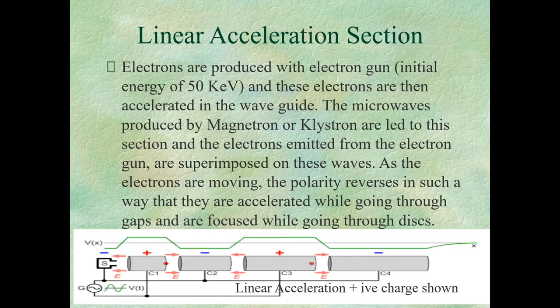So the target is water cooled, as a lot of heat is generated in the process. On accelerators, you may have seen that we either have chillers or we have city water to keep the accelerators cooled. And one of the cooling is done for the target. It absorbs most of the incident electrons. So the incident electrons that are coming in 2 millimeter or 3 millimeter as a pencil beam are absorbed here. And an X-ray beam is produced.